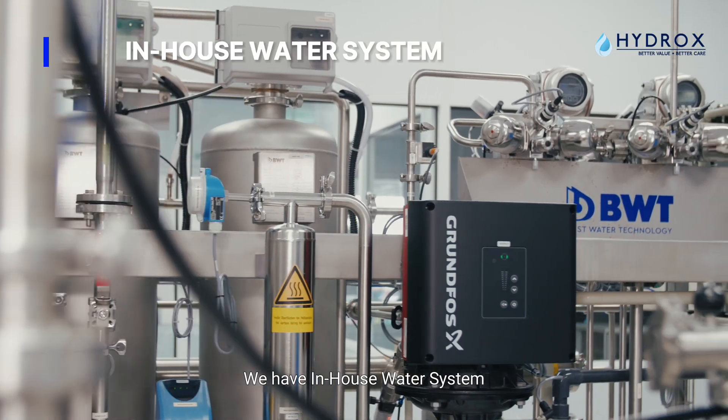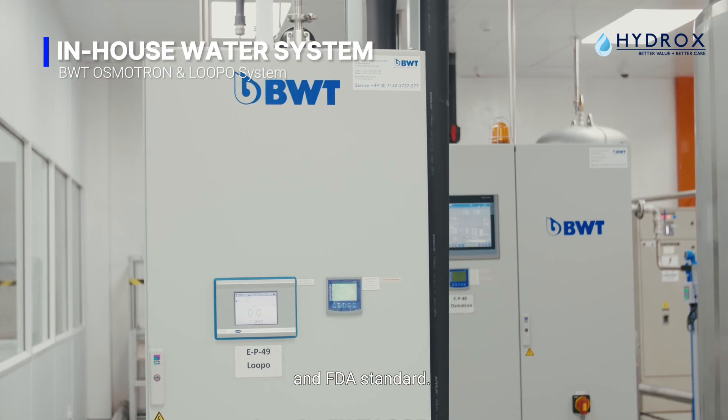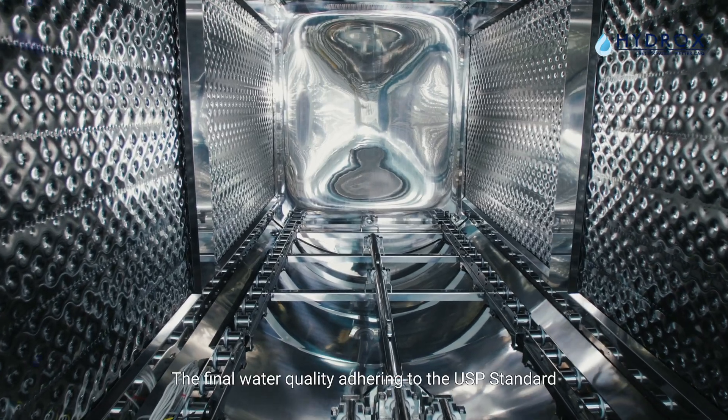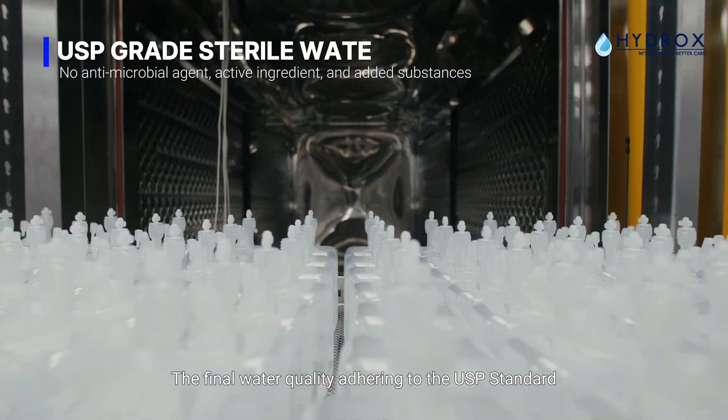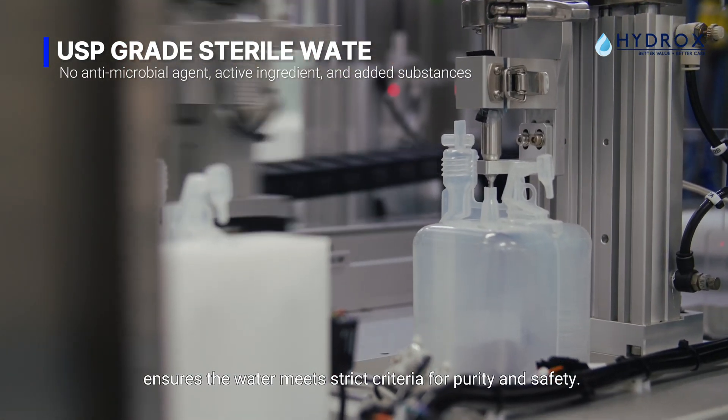We have an in-house water system in accordance with GMP guidelines, ISPE engineering guide, and FDA standards. The final water quality adheres to the USP standard, ensuring the water meets strict criteria for purity and safety.